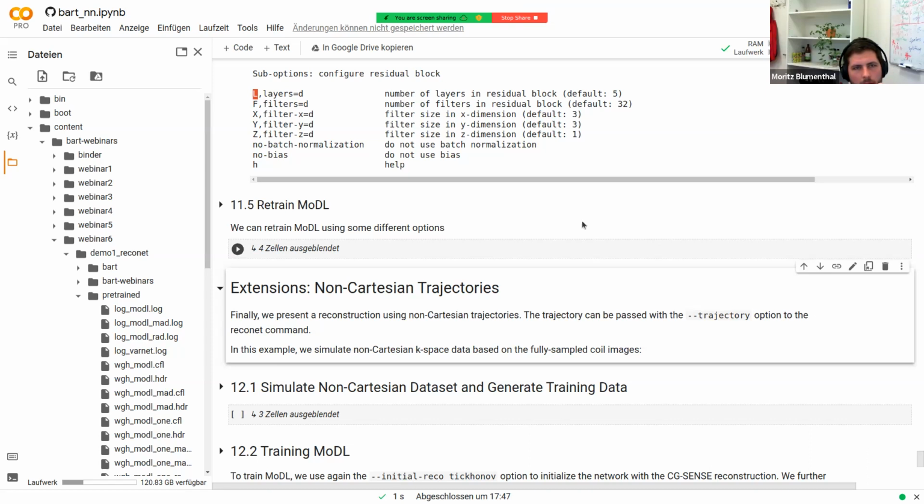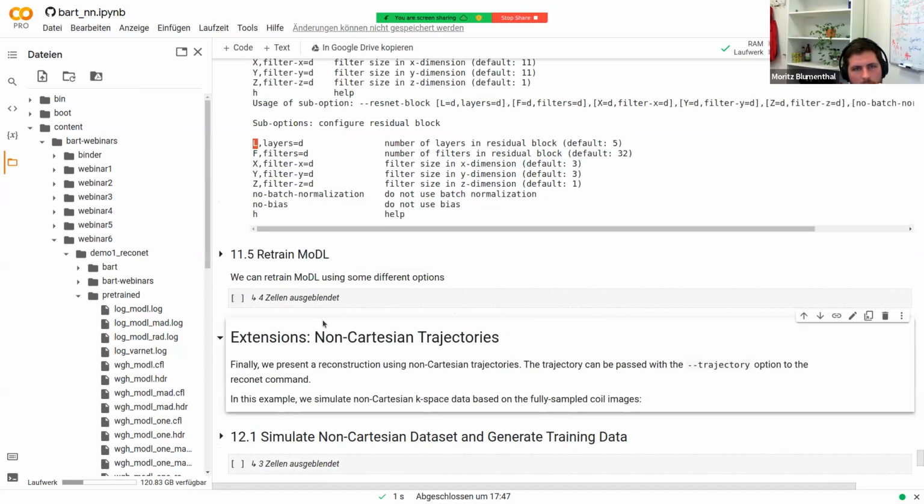But it is the case that if your data set was inherently 3D, then everything would translate to 3D networks, 3D normalization, and 3D reconstruction. It would, but I never tried that. So you could try that, but I expect that it explodes memory. And so I never tried that on a full 3D data set. But maybe we could get in contact with anyone who wants to try that and work together on that.